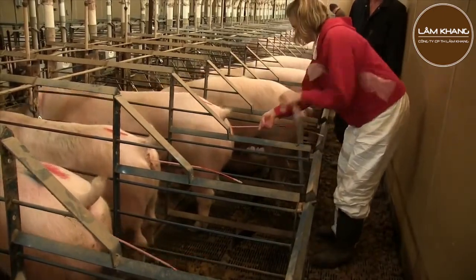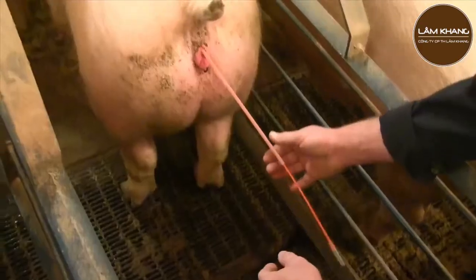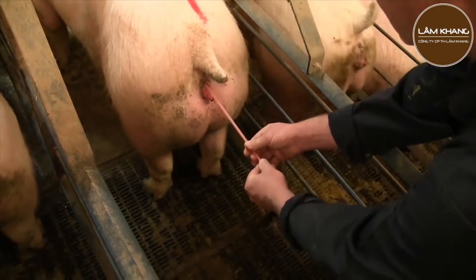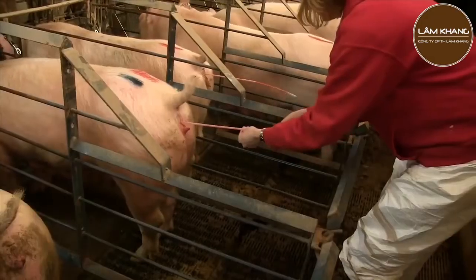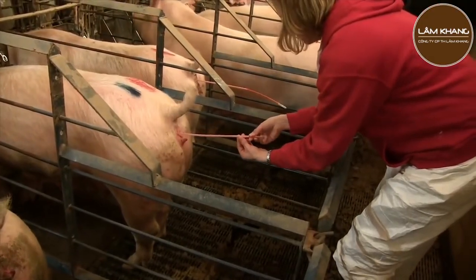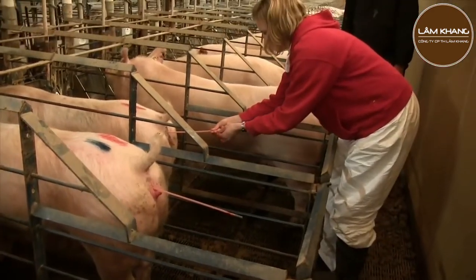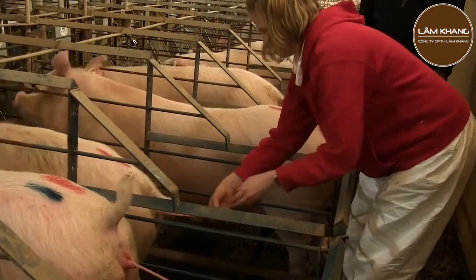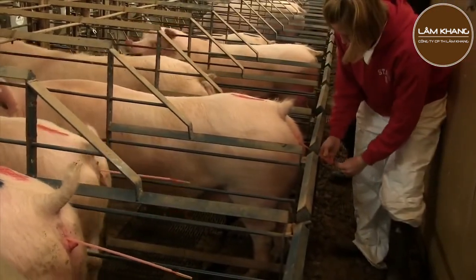Now I will advance the inner catheter through the cervix past the remaining interdigitating pads. Depending on how long the sow has been in estrus, it should be possible to feel the inner catheter advanced past 2 to 3 pads as seen here. The size of the sow and the brand of the PCAI catheter will dictate how far to advance the inner catheter. For this brand used to demonstrate, most sows can easily accommodate the entire length of the inner catheter.